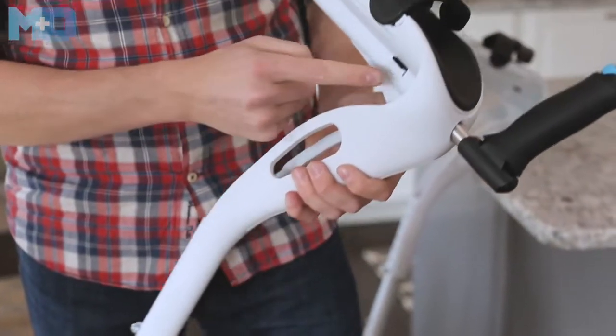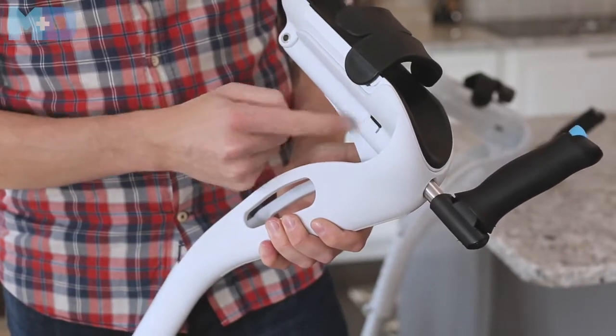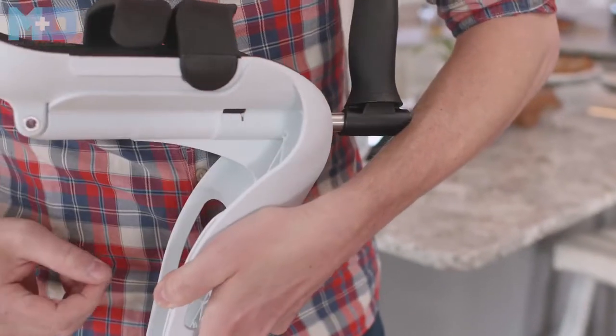Naturally, to lock your cradle, all you have to do is push on the slide lock. On that side, on the lock side, you can feel that there's a little braille dot that signifies to you which side is the lock or unlock without having to actually look at it.